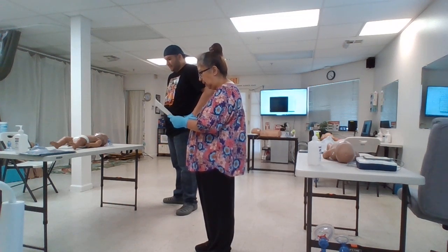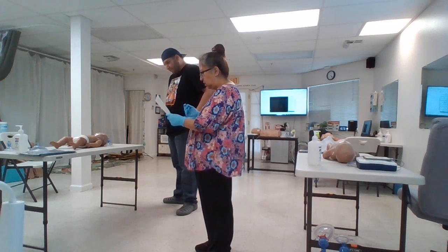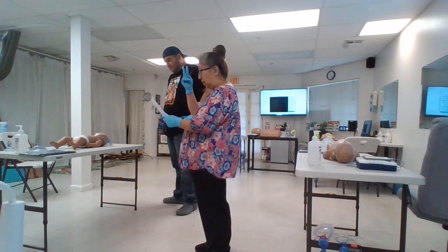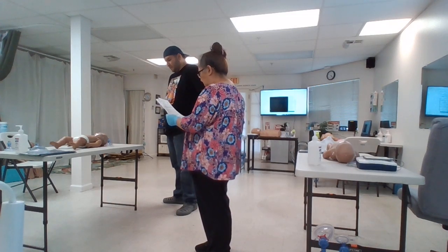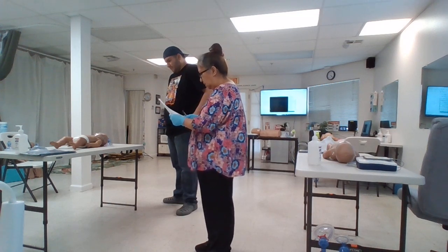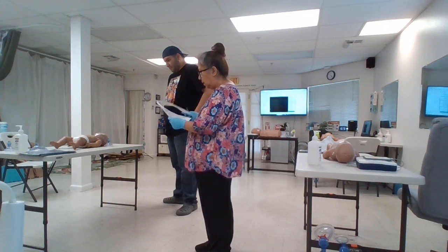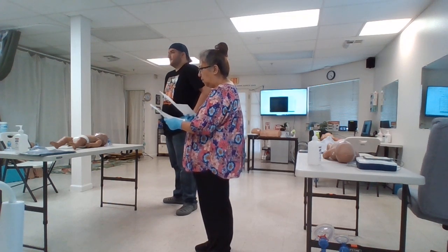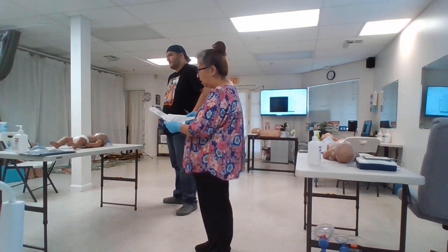With the pocket mask. Okay. And then on the third cycle, another person is going to come in. So this time it's going to be 2 rescuers. Because there are 2 rescuers, you'll be switching to thumbs instead of fingers. Casey, you'll be the second rescuer. You'll be giving 2 breaths at the end. So that's how it is.